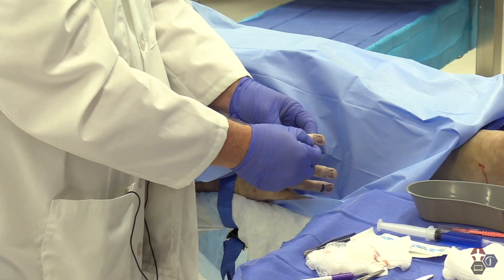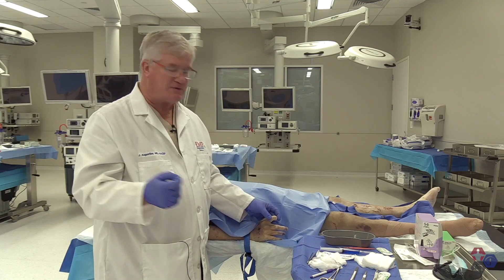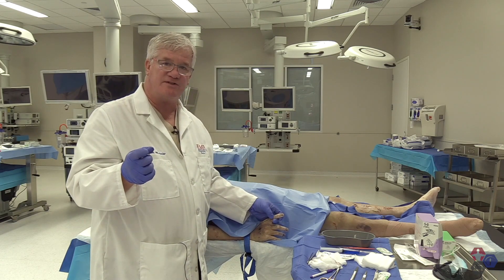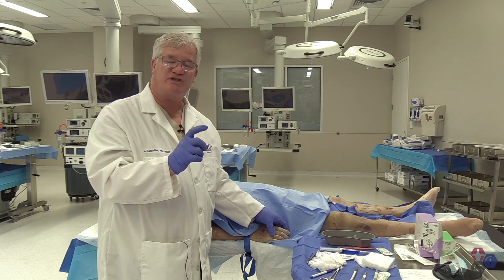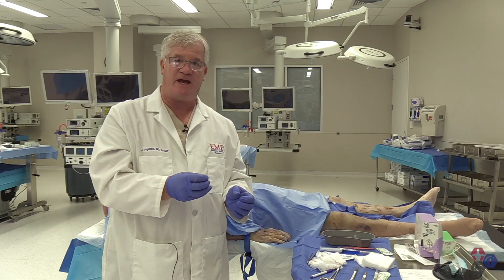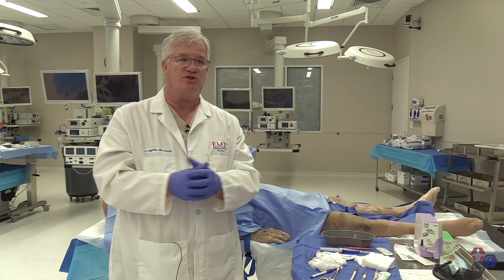Any laceration occurring over the IP joints typically will not hold together with either glues or Steri-Strips. Those are areas where we need to place a small set of sutures over those IP creases and joints, then again position the hand in a position of functionality with a splint on the opposite side of the joint. The hand is a very important place to understand what lies deep underneath, provide good skin closure, and ensure long-term wound care instructions and follow-up for best patient functionality.